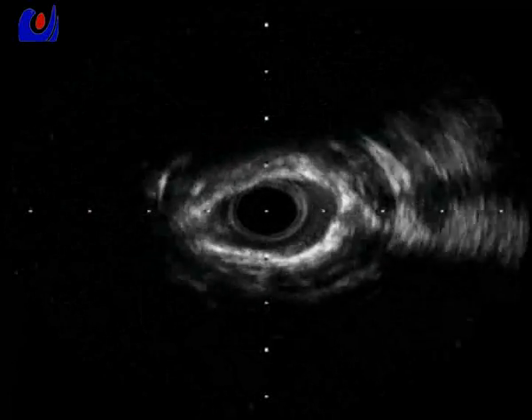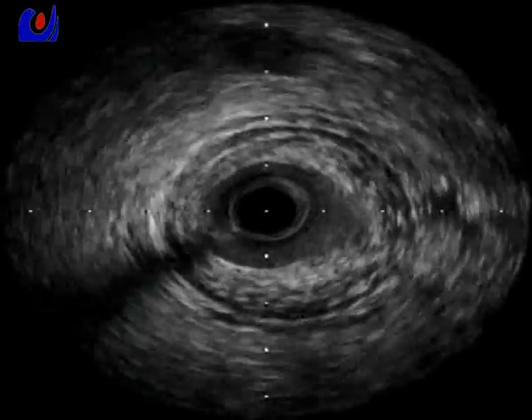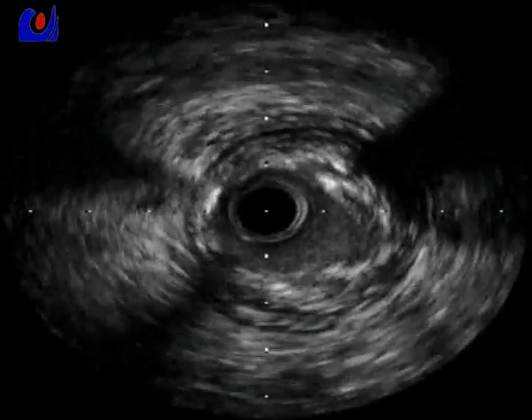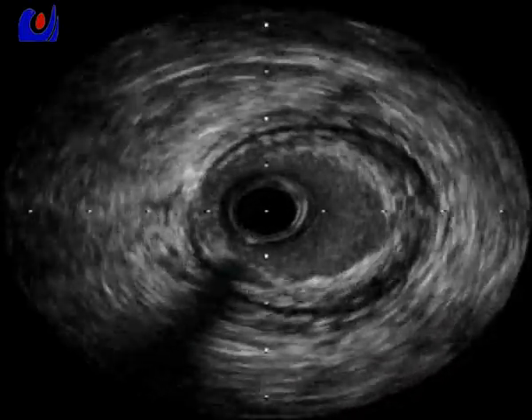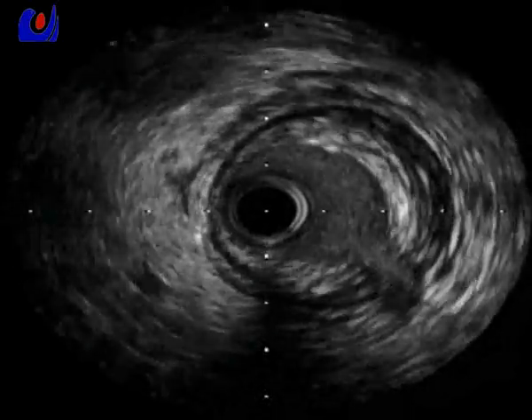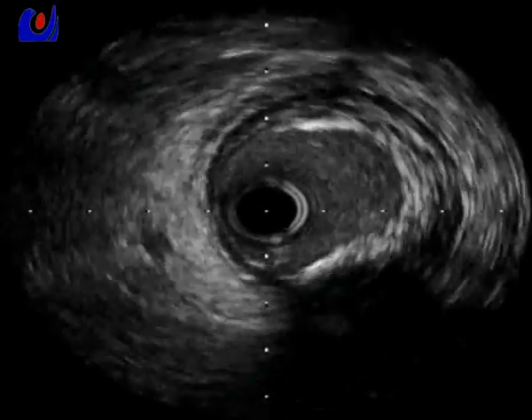Soon after this, we can see the wire joining from the circumflex, so it should be at 7 o'clock, and this is the distal left main, also quite calcified. We can see some spreading of the calcium line too. The left main is somewhat not big, at least only 3.5.